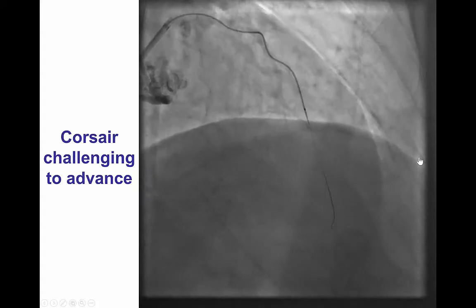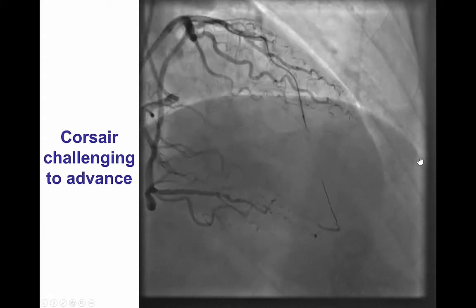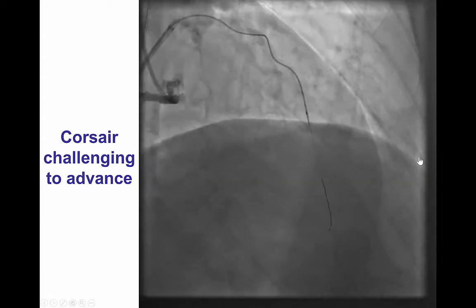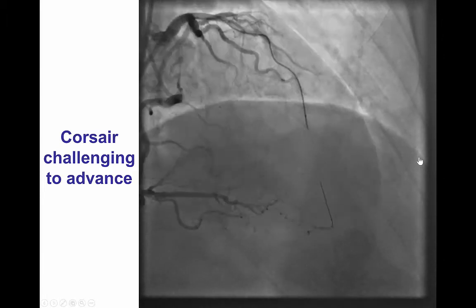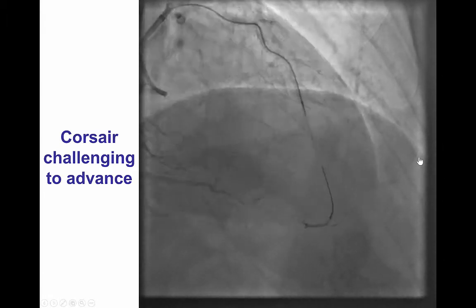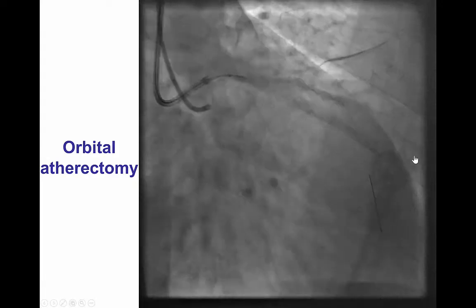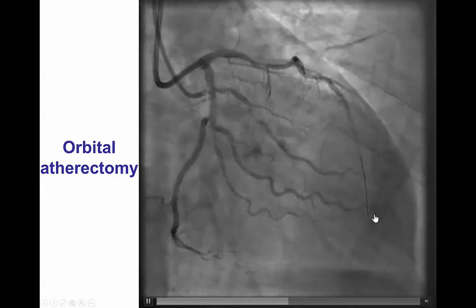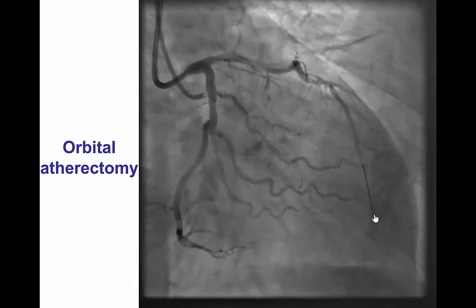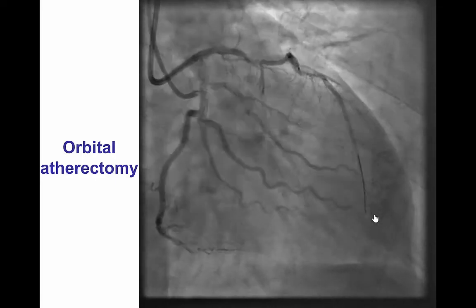We did have significant difficulty advancing the Corsair microcatheter through the occlusion. That was likely due to the calcification as well as the tortuosity. However, we were able to advance it, and then we switched the guide wire for an atherectomy guide wire and performed orbital atherectomy of the entire LAD.